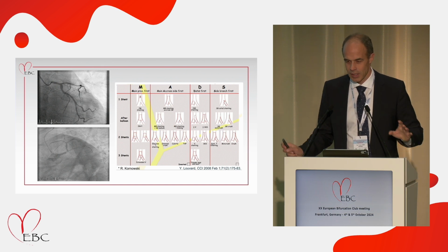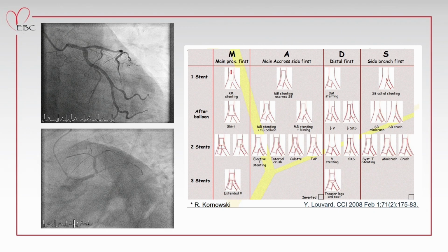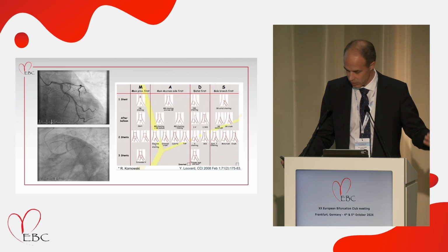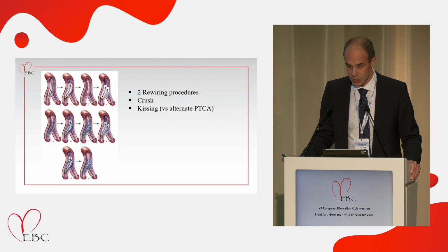Now, of course, this is something that you're familiar with, the MADS technique, and what I want to present here is that all the lesions treated in this little trial were very complex. They had at least two of the paradigms of complexity as defined in the DK crush trials: very calcific lesions, some with thrombus, and definitely left main lesions.